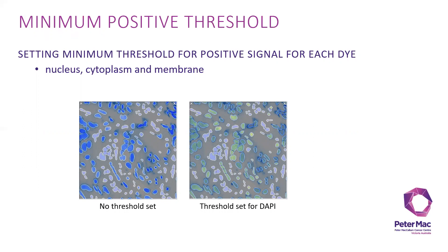Nucleus usually is for DAPI, cytoplasm you can use again, and membrane depending on the marker you're trying to set the threshold on. For this specific example, I use DAPI. When there's no threshold set, it's light blue purplish color, and when it's set for DAPI, it turns yellow.